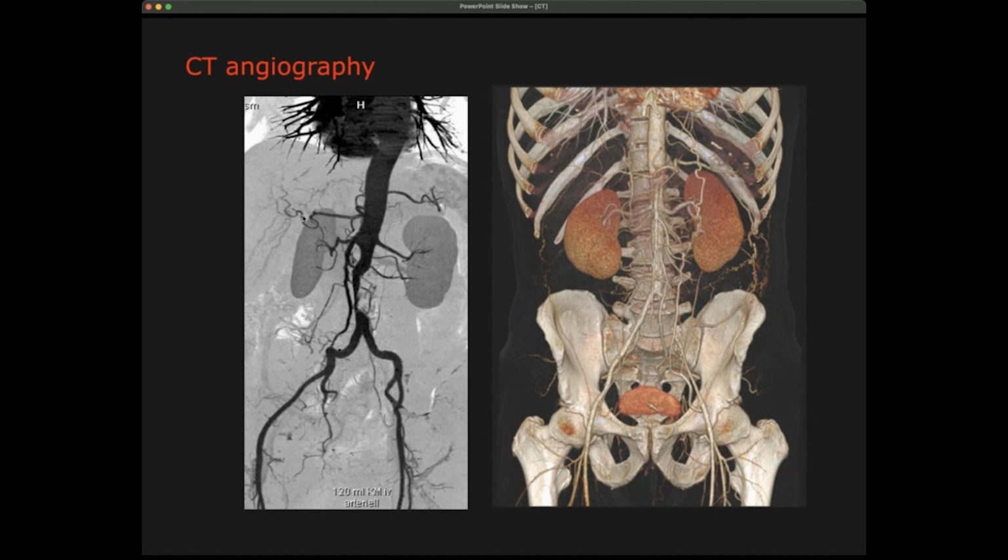And you see all the nice different vessels, of course. And you see here, for example, the kidneys, which, as I showed you before, they have a higher perfusion. And so you would see a bit more. You can actually do 3D renderings of this. So if you render it with the highest intensities, you can nicely see these organs. You obviously see the bones. So it's very difficult to go out of the bones.